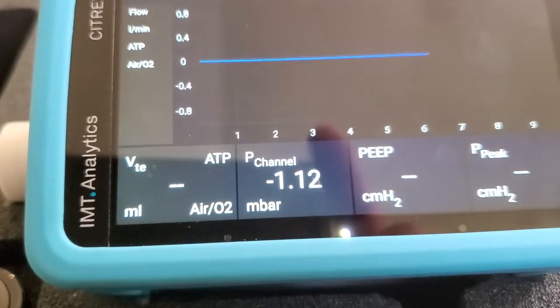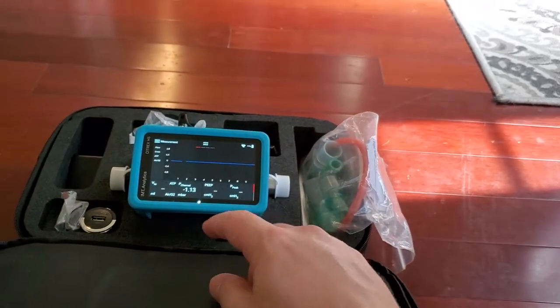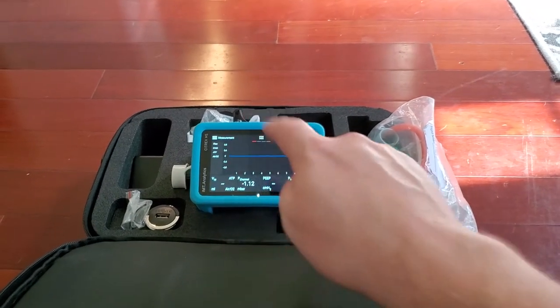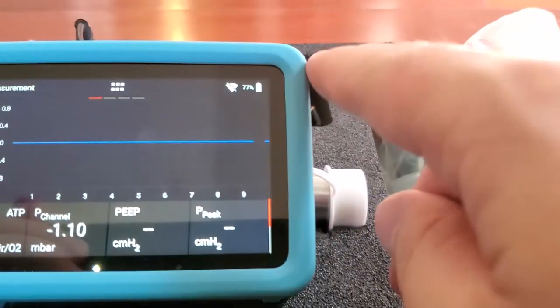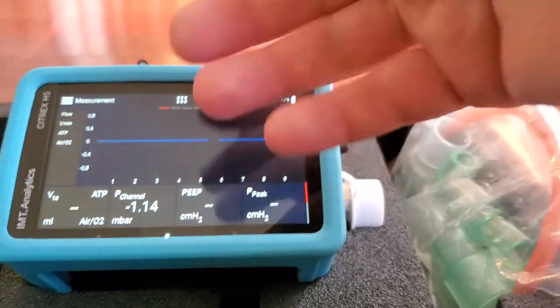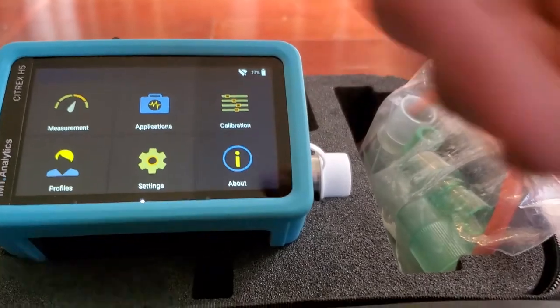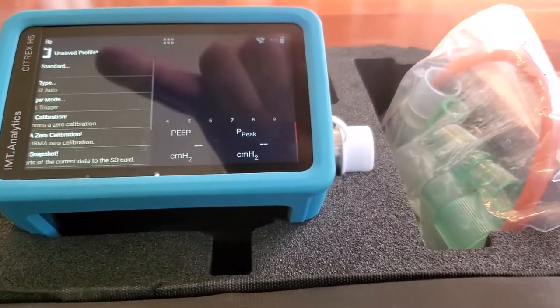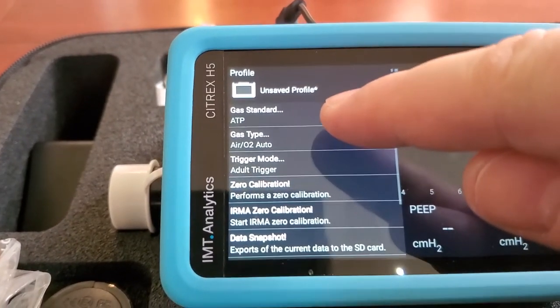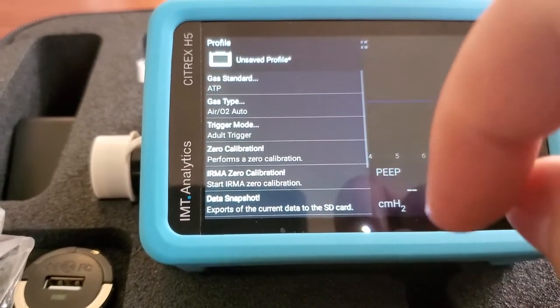Look at the resolution of that display — that is insane, guys. The font is so clear. It's battery powered, it's got Wi-Fi. Since this looks like Android, it looks like they inverted the interface and the menus are up at the top. Let's try Measurement — there's the menu. Oh look, you can change the gas standards, change the trigger, and do calibration. Nice!